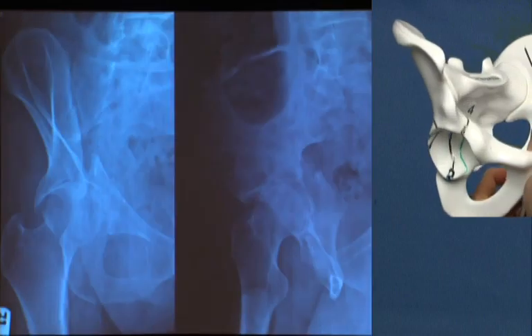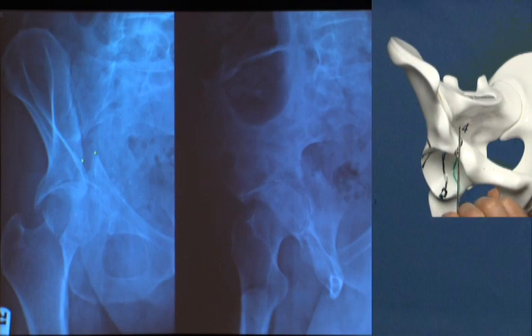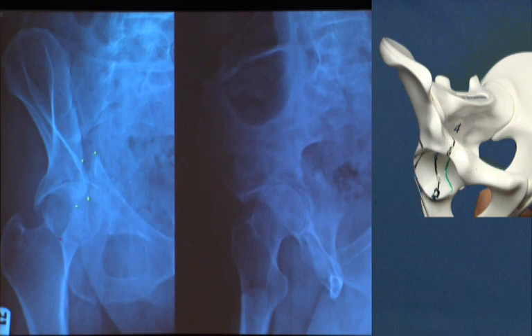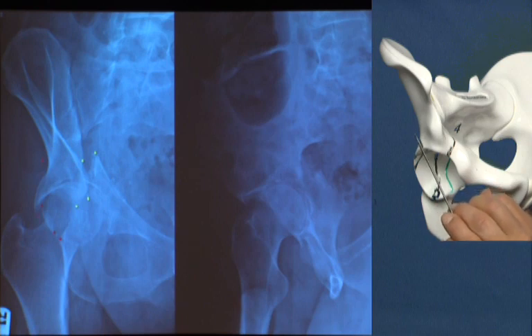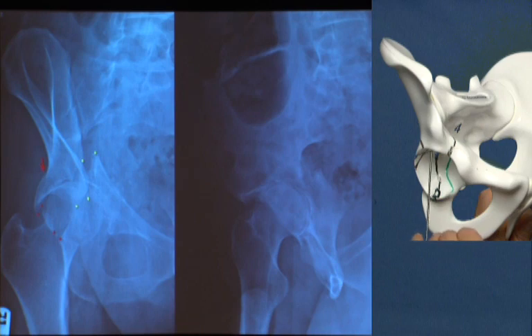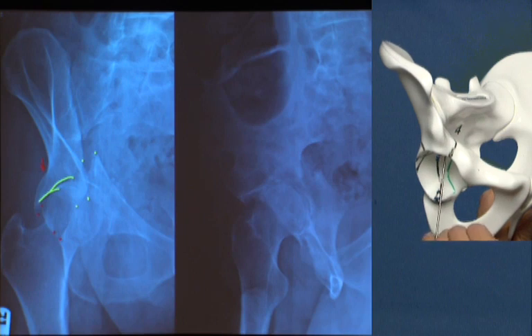I have this portion of the roof that is intact, an impacted fragment sitting a little bit more medial to the roof, and an impacted fragment that has gone with the acetabular fracture creating that double density on the AP X-ray of the roof shadow. Looking back to the oblique views: the obturator oblique view matches — we can see the main plane of the fracture line, and following it down it appears to come all the way out and down to the low posterior aspect of the posterior rim. We have a secondary large displacement of the posterior rim, and a vertical fracture line creating that small secondary posterior wall fracture. No fracture lines entering the obturator foramen.